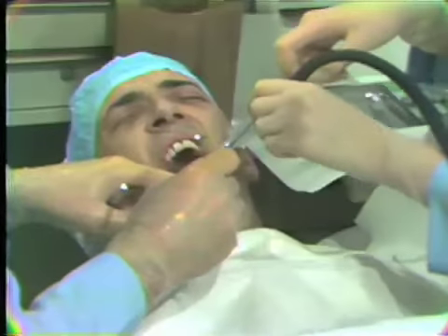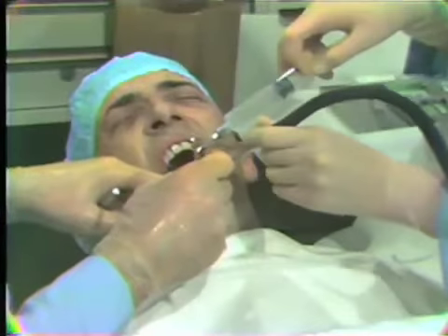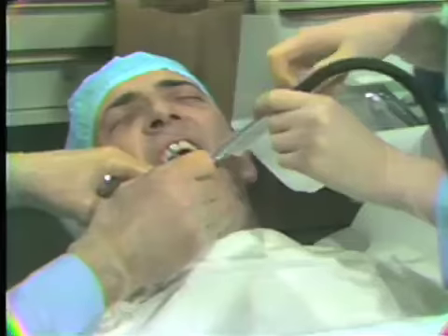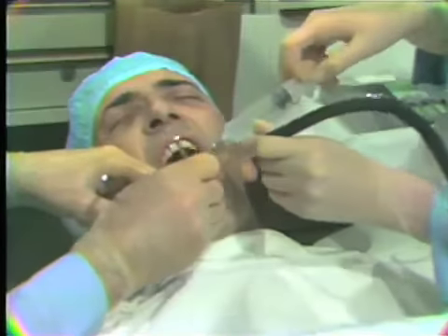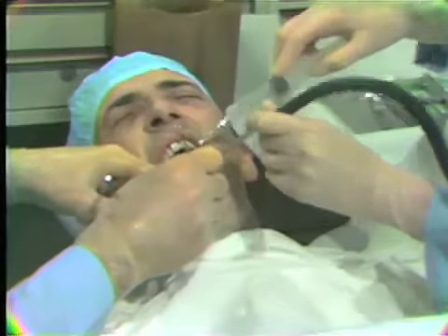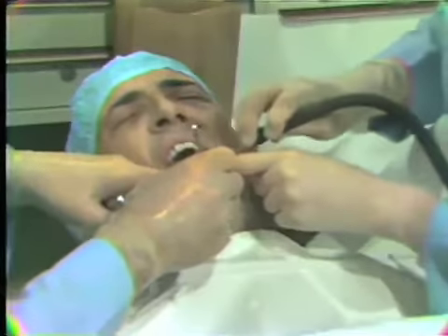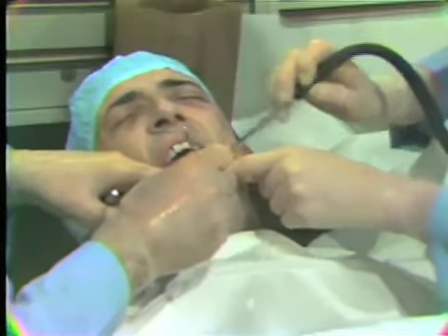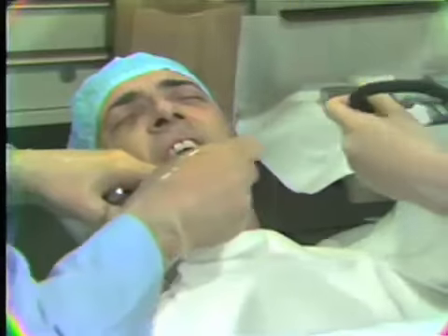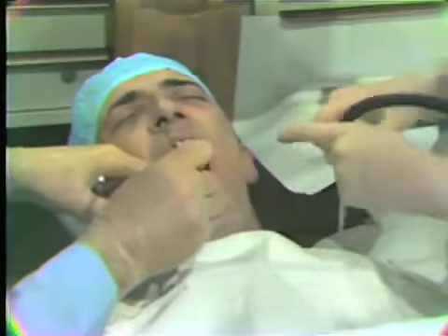The irrigation with saline cleans the root surfaces, cleans the crestal bony areas so that we can see more clearly the root surface to make sure that it's smoothly planed and is free from calculus, as well as giving us a view of the crestal bony contours so that we can observe any bizarre patterns of bone or see if there is any necessity for reshaping of the bony edges that may be quite prominent or not placed so that the desired contour is gained.